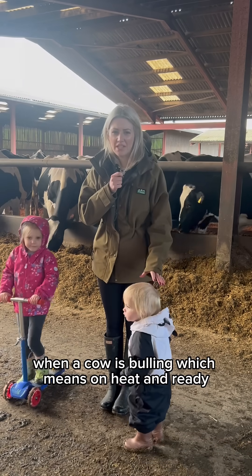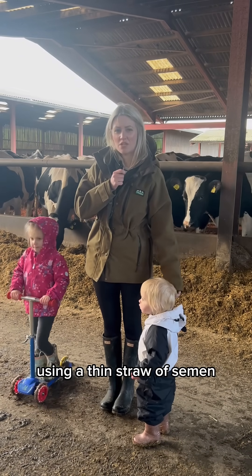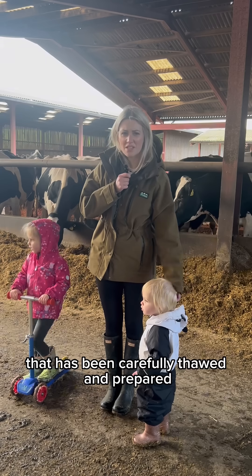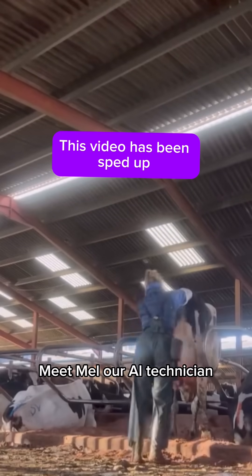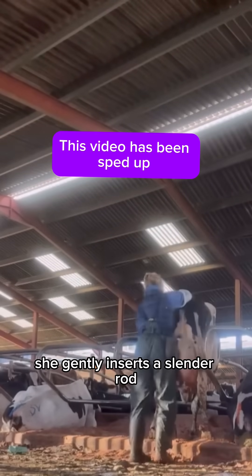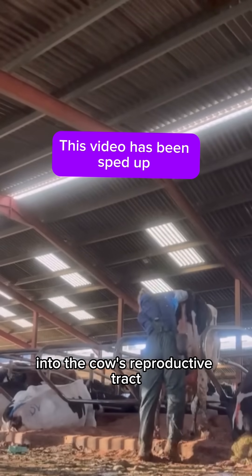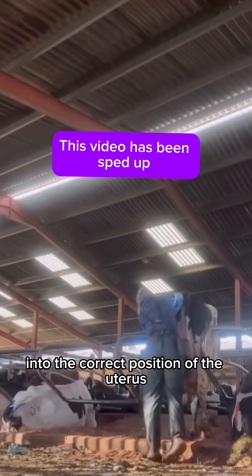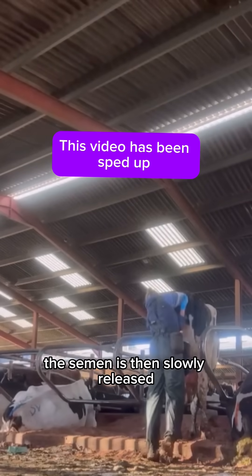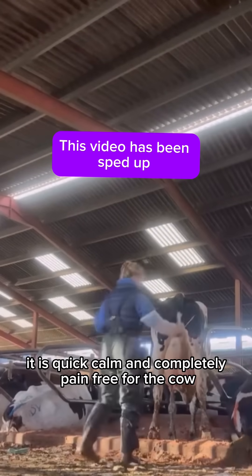When a cow is bulling — which means on heat and ready to be bred — we inseminate her using a thin straw of semen that has been carefully thawed and prepared. Meet Mel, our AI technician. She gently inserts a slender rod called an insemination gun into the cow's reproductive tract, whilst one hand is placed on the rectum to guide the rod into the correct position of the uterus. The semen is then slowly released. It is quick, calm and completely pain-free for the cow.